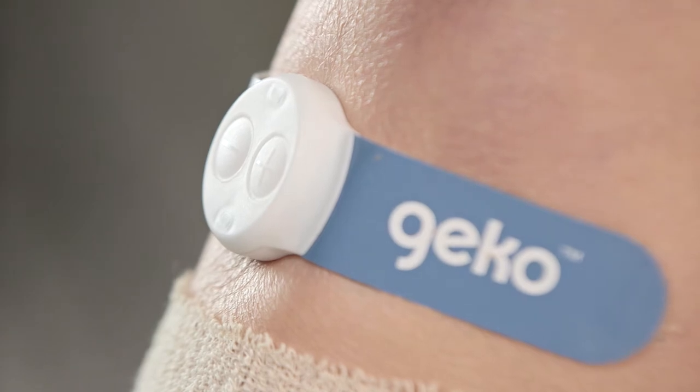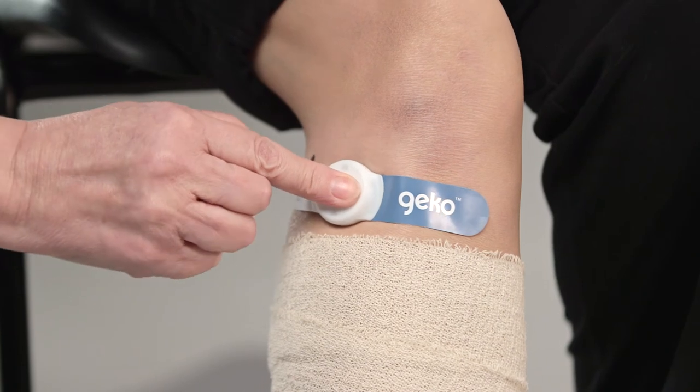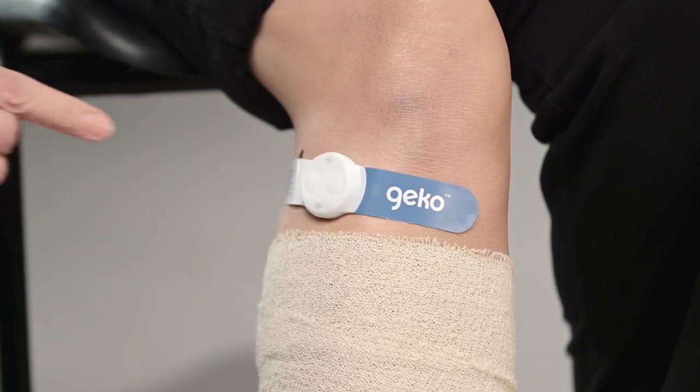Note that on the left leg, the Gecko brand name will appear upside down. Once in position, use a short press of the plus button — 0.5 seconds — to turn on the device.